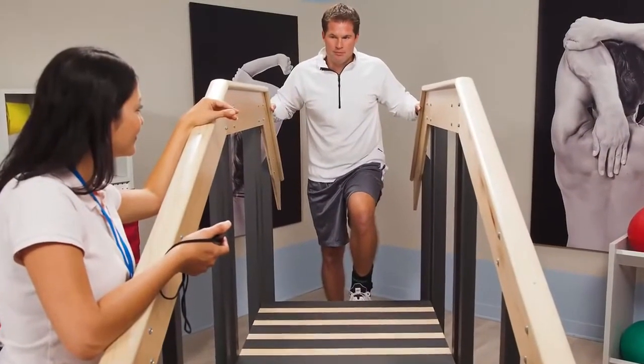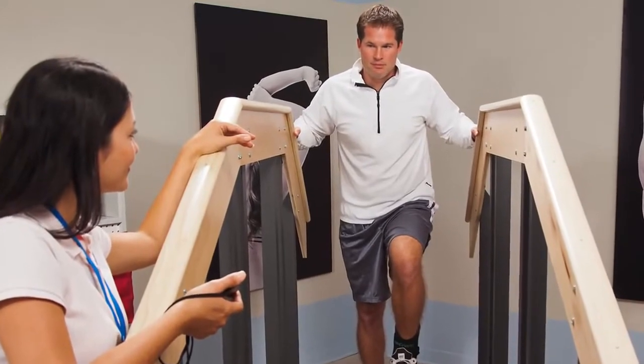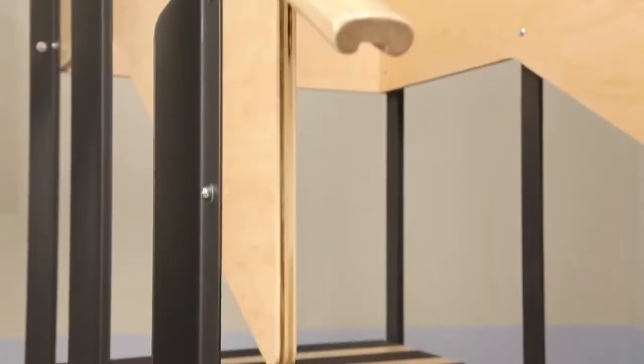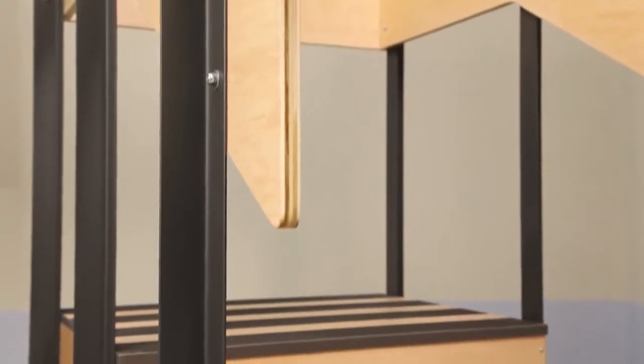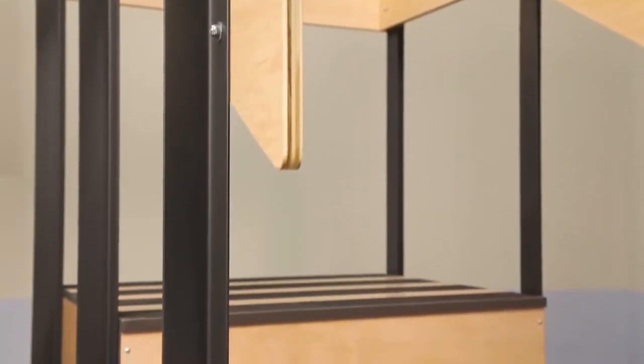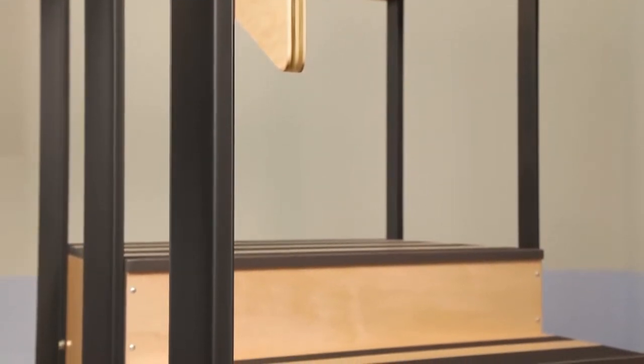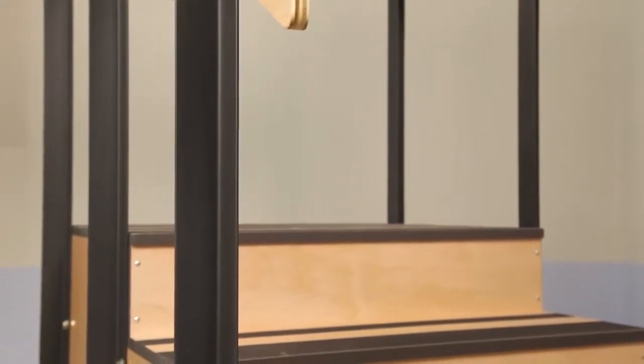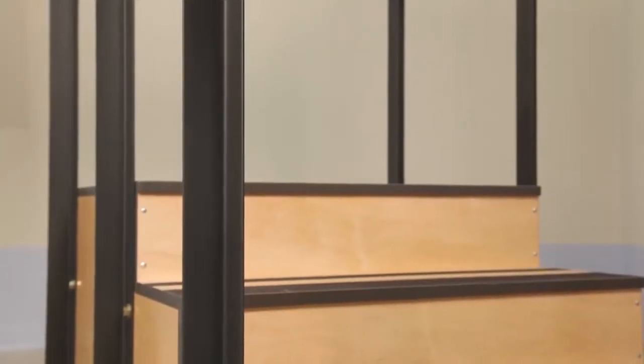When using staircases for rehabilitation or to extend range of motion and mobility, confidence is paramount. While other manufacturers use wooden uprights, Clinton engineers prefer the time-tested strength of steel upright supports. Steel at all the main pressure points provides every Clinton staircase with firm, steady support for the entire length of the handrails.